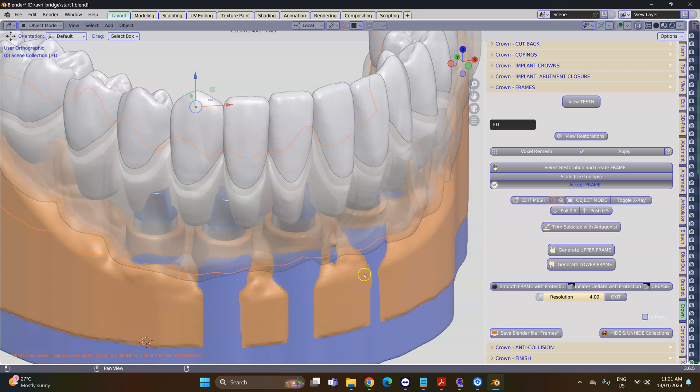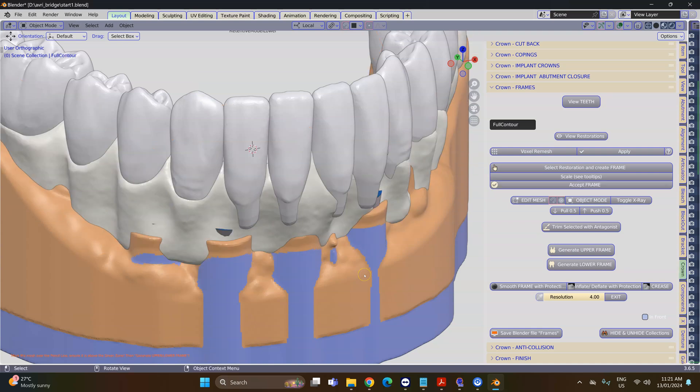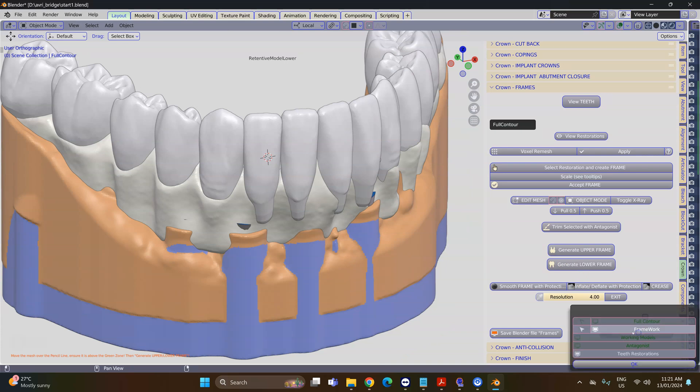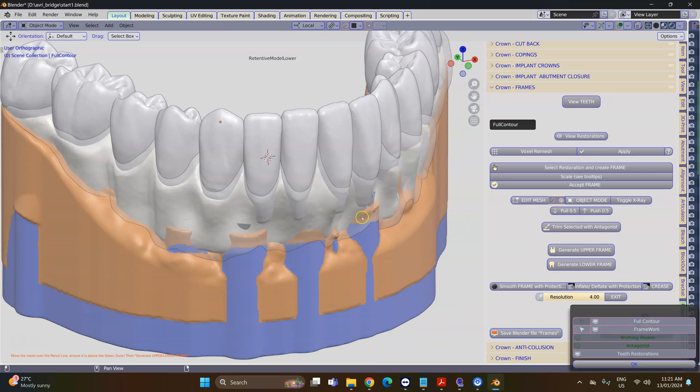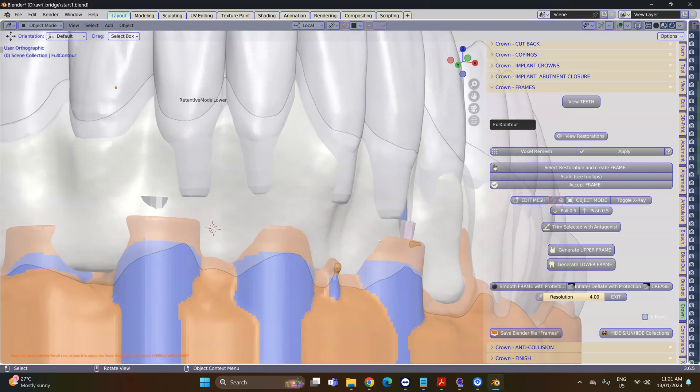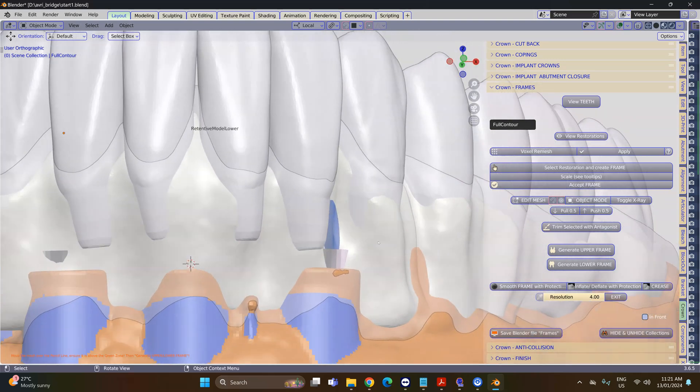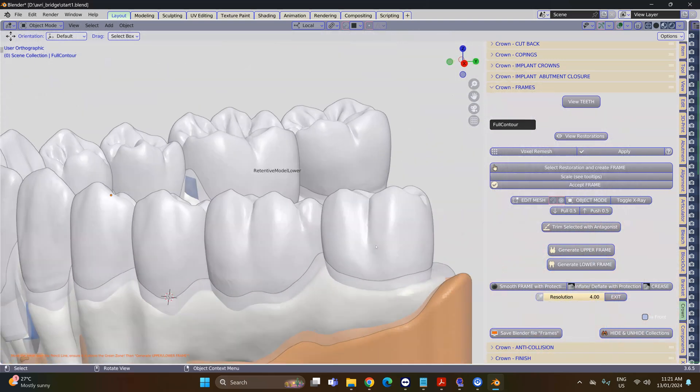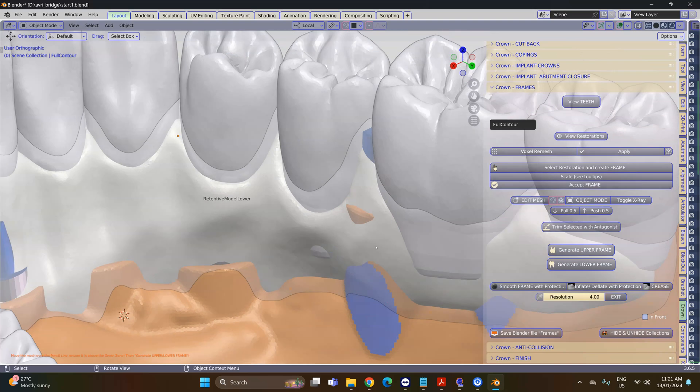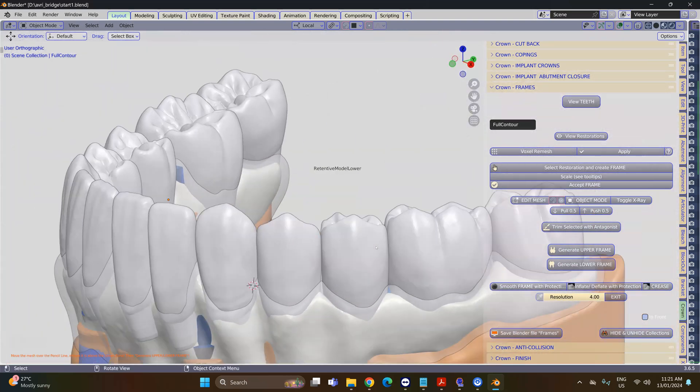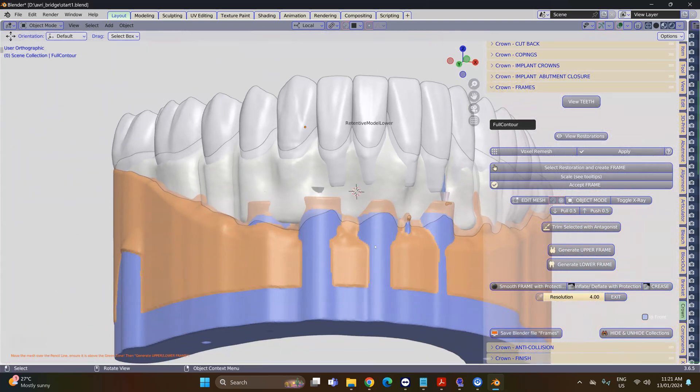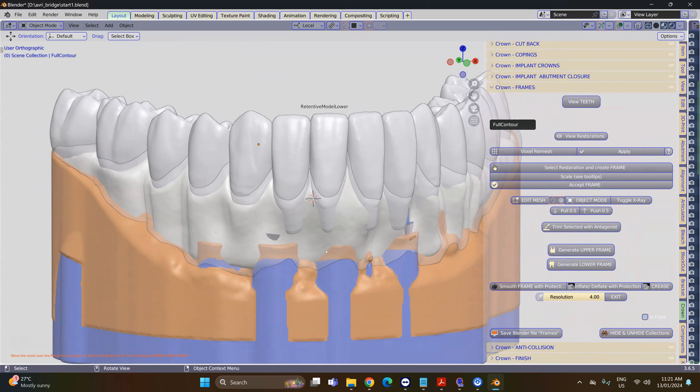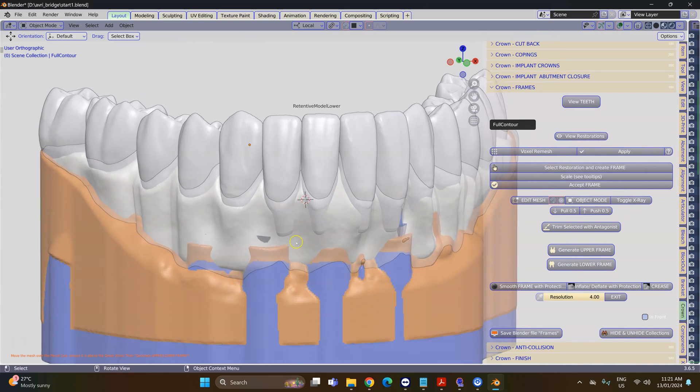Following that, you're going to have a reduced object. We're going to demonstrate where the full contour is—that's a full contour and the reduced contour underneath it. Now we want to use that one because this is where we're going to manually add composite or porcelain.